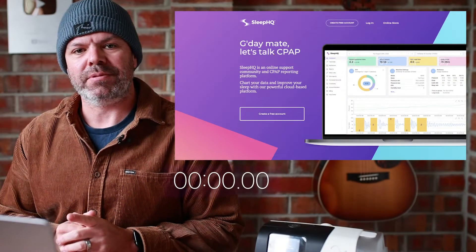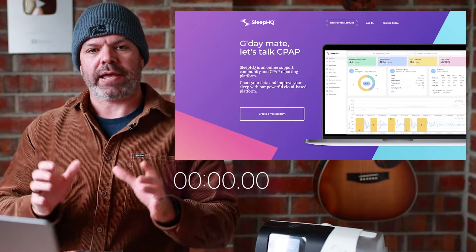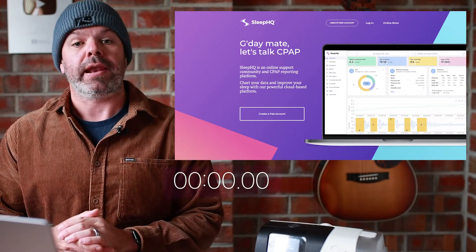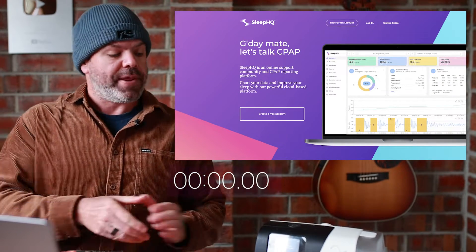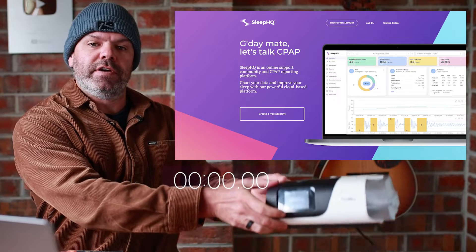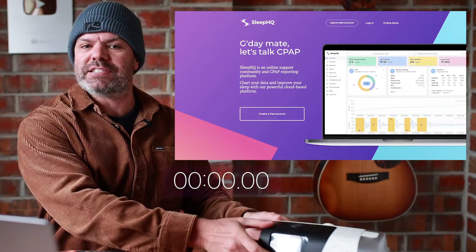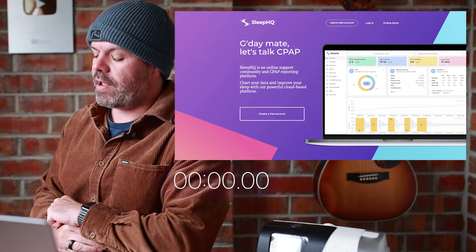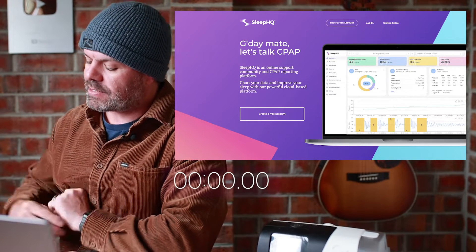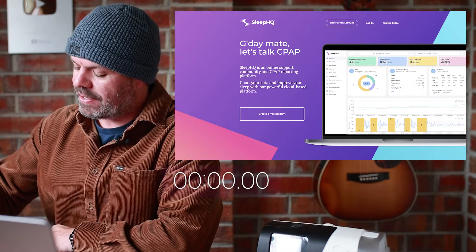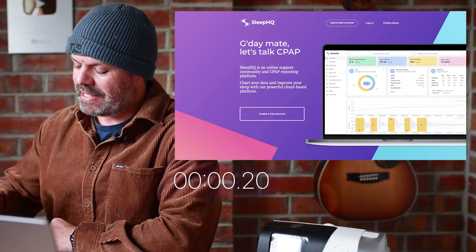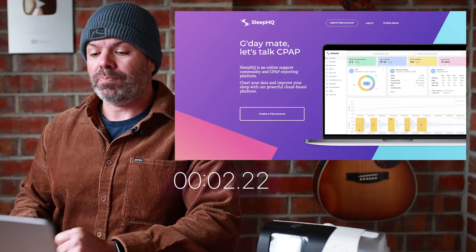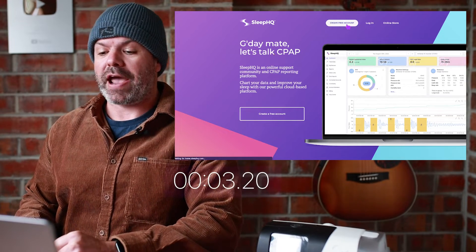G'day mates! Let me show you how to track every single breath and every single apnea that you have using your AirSense 11, in under one minute flat. On your marks, get set, let's go — visit sleephq.com and create a free account.